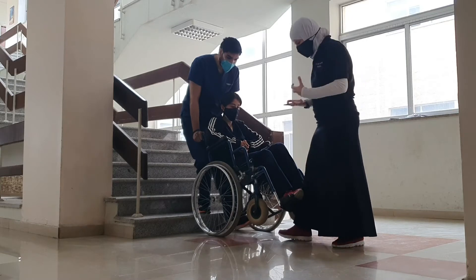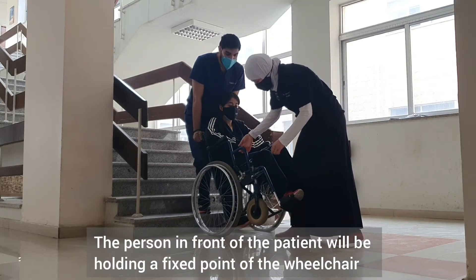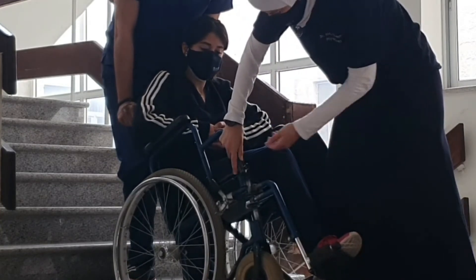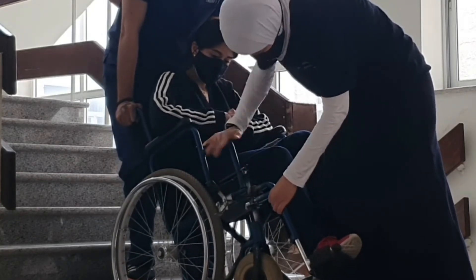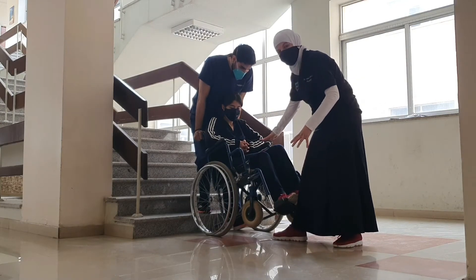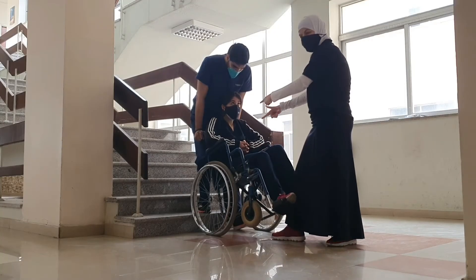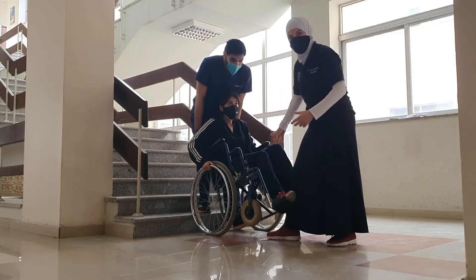The person in front will need to find a fixed part of the wheelchair. We need to make sure we are holding a fixed part — for example, we don't hold the movable parts because under weight they might move and we could lose control of the patient. The same applies to the footrests. On this chair, the fixed part is the frame of the chair itself. The person on the wheelchair will tell the assistant where to hold, and the person on the wheelchair will hold the push-down mechanism.